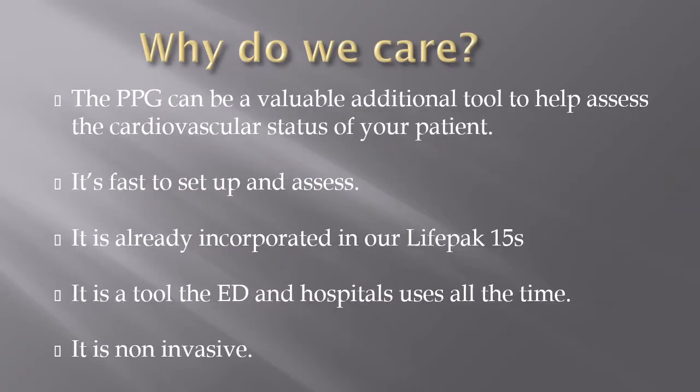So why do we care about the Pleth? The Pleth can be a valuable additional tool to help assess the cardiovascular status of your patient. It's fast to set up and assess, and it's already incorporated in our LifePak 15s, so there's no additional cost to the department. It's non-invasive, and it's a tool that the EDs and hospitals use all the time. If you're able to explain a Pleth to the doc in the ER, you'll look like a rock star.